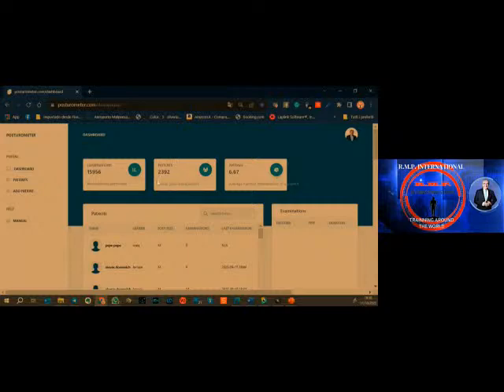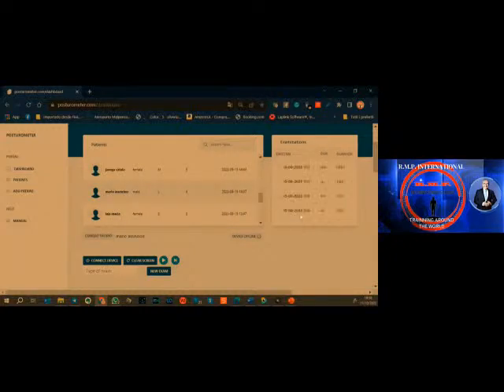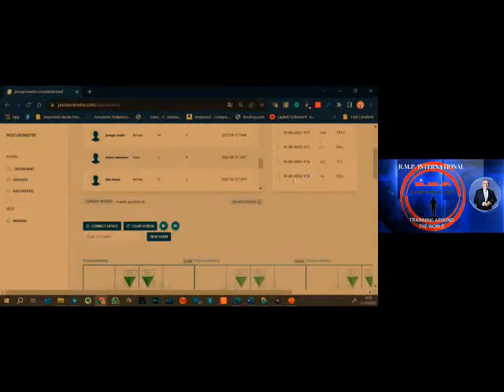Look here. This is the whole mission we had. 2,392 patients with 15,956 readings. That's a lot of experience. And then we see one patient. Let me choose one. Anyone. If you choose a patient, you see here the three exams. First, second, and this is recorded.